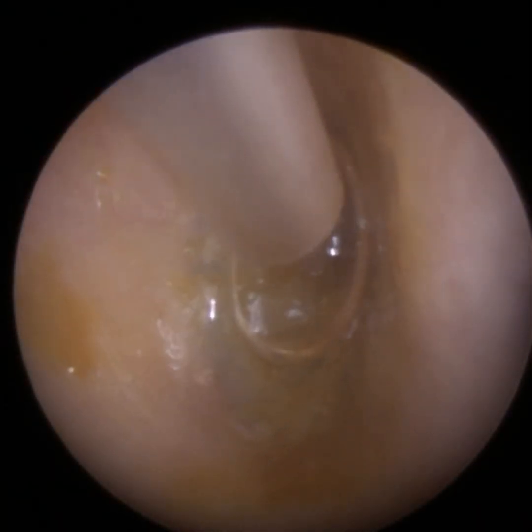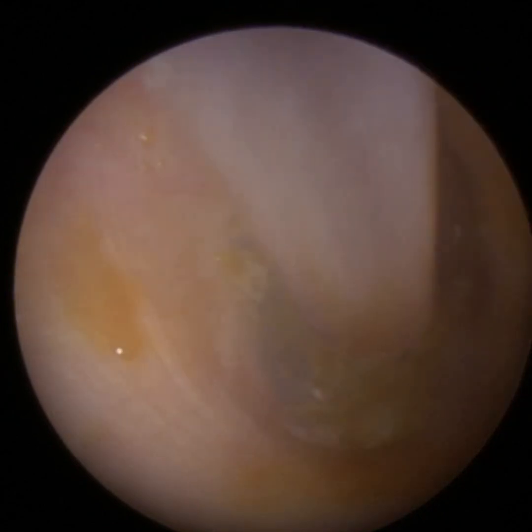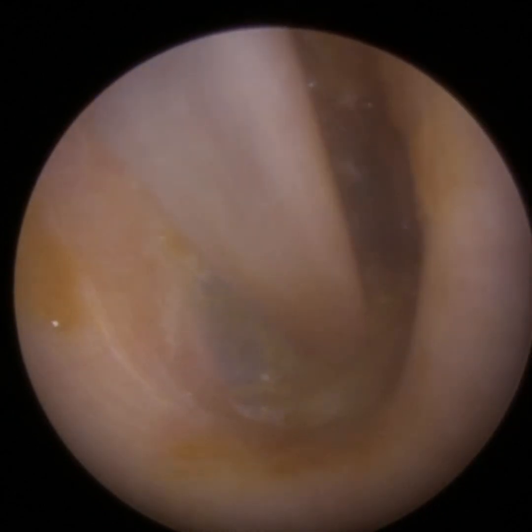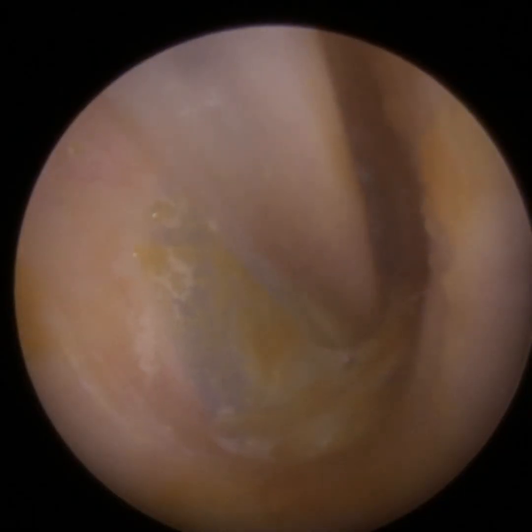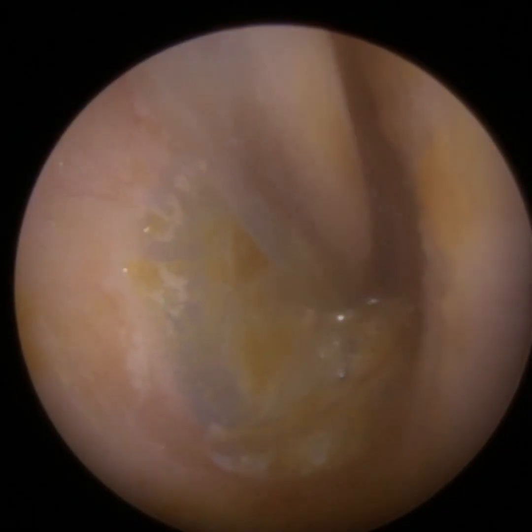So when the patient did attend yesterday, we did actually remove the left ear first, but I just thought, for the purposes of this video, I'll explain the right ear procedure first because it's a lot shorter, and then we'll proceed to the left ear.